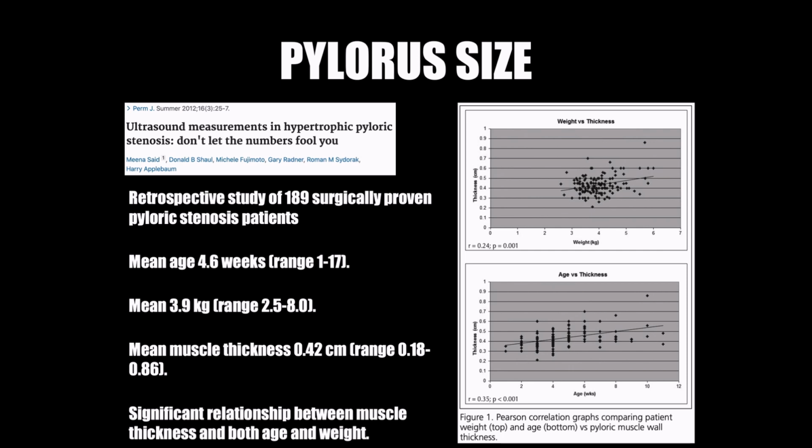Another concept to keep in mind if you're getting those borderline measurements that aren't quite reading that 3 millimeter mark but just a little bit shy is the potential for pylorospasm. This occurs when the pylorus is contracting. It obviously gets thicker when it contracts, and with that contraction, that thickness may start to approach the level of pyloric stenosis. Usually you're not going to clear that full 3 millimeter mark. It's typically going to be more in like the 2 to 2.5 range.